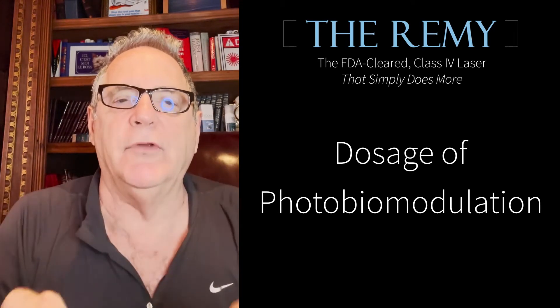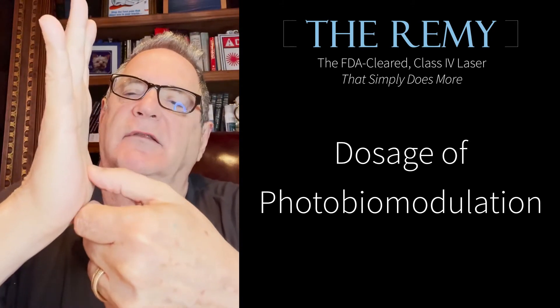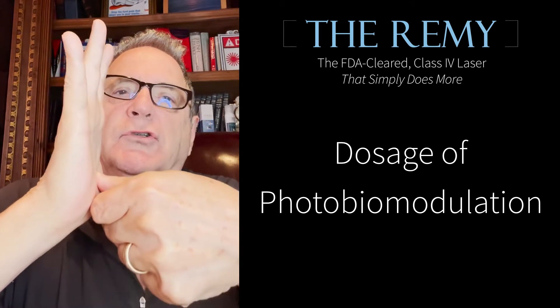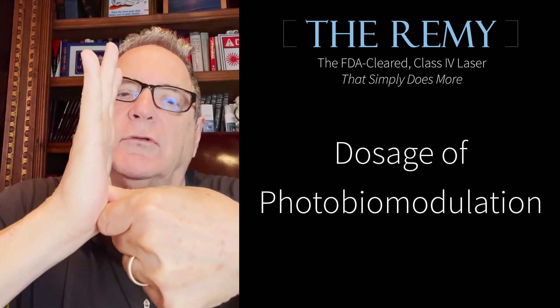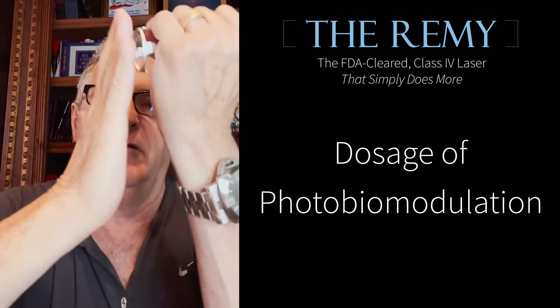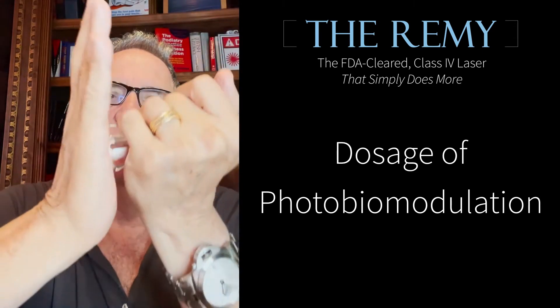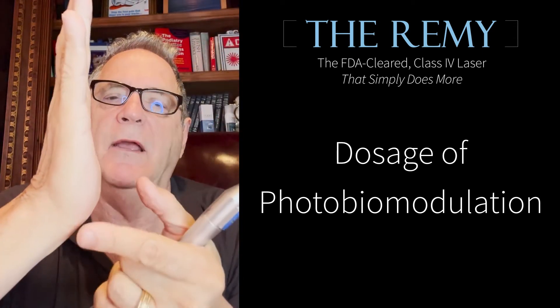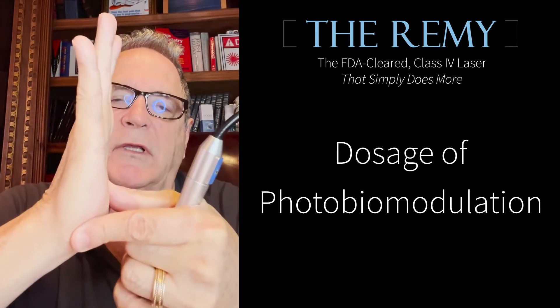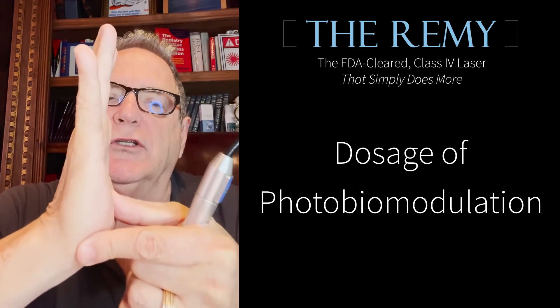How do you know you have the right dosage? Here's the plantar fascia. Typically, the pain is at the plantar medial insertion — you press on it, it hurts. You then treat the entire area; this is the handpiece, moving up and back over the entire area. After about a minute, you press on the area — it should start to feel better, and you know you're finished.